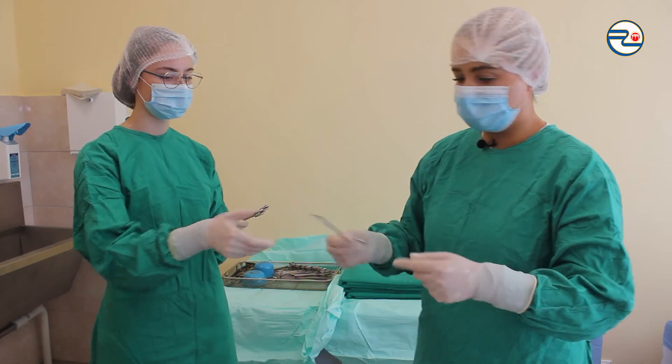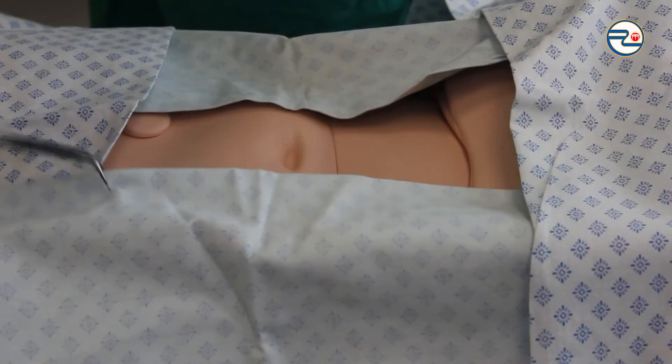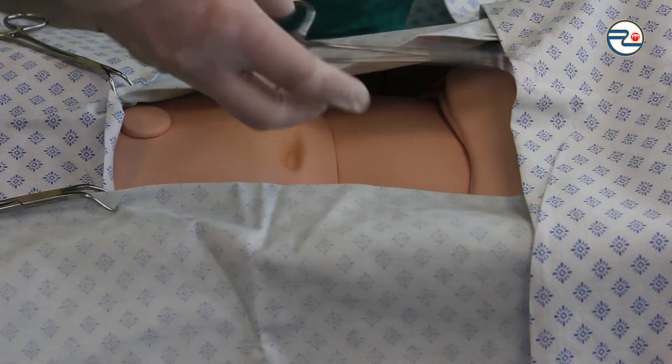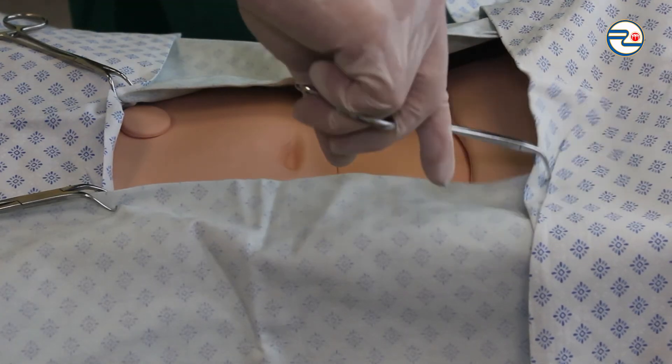I'm leaving open only the area needed for the incision, and if necessary, for drain placement. I'm pinning the drapes with four sterile clamps.